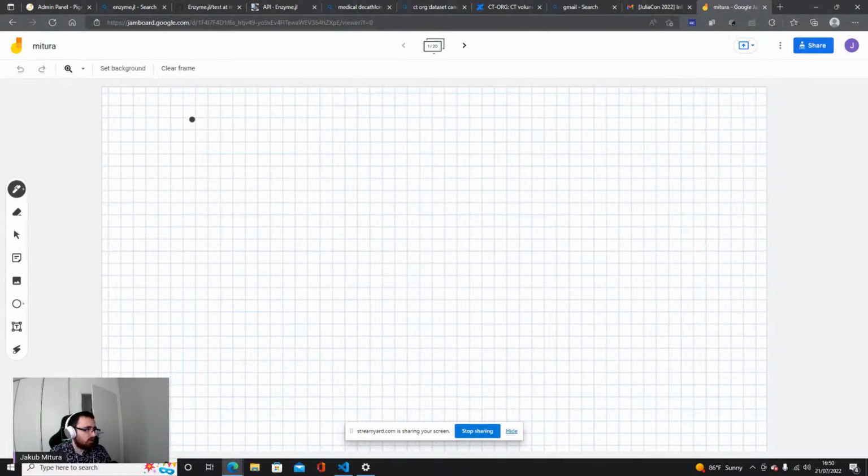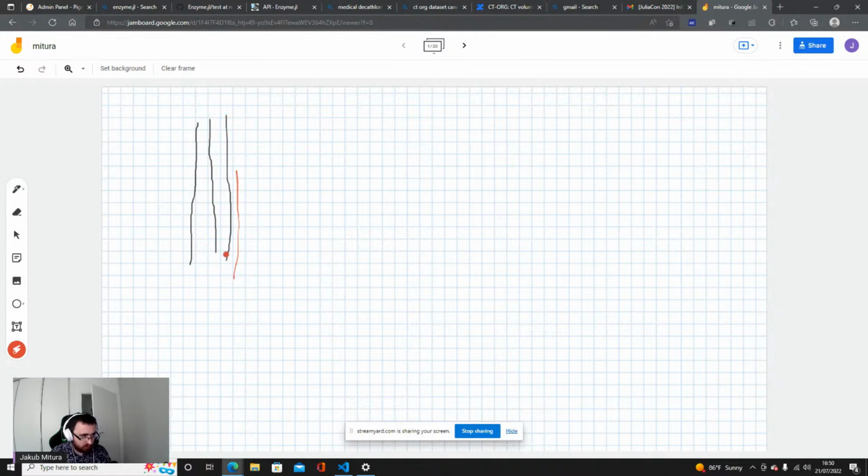So basically, when we have the data, let's imagine this as 2D data for a moment. They are in layers, basically. So this one could be CT, this could be a layer for the manual modification, this can be the layer for the label. So they are one over the other. Each is also described as a texture, just because of how the OpenGL defines it. The OpenGL is the library for visualization. Basically, it's used, for example, for games, so it has relatively high performance.